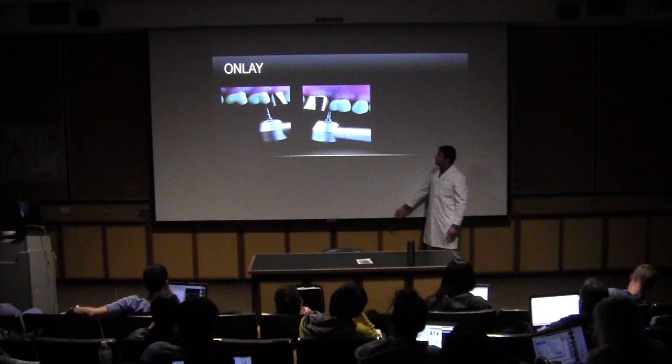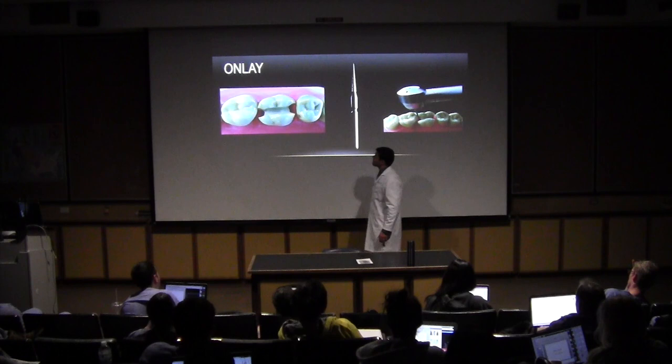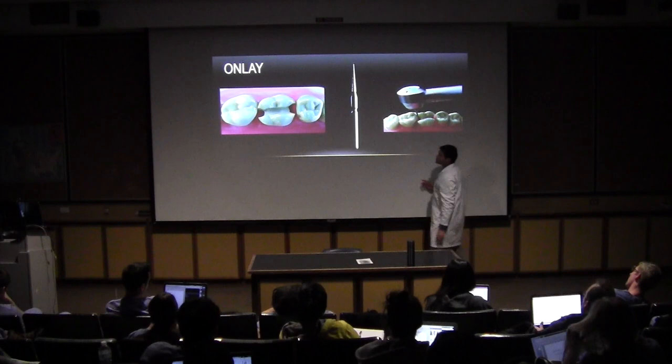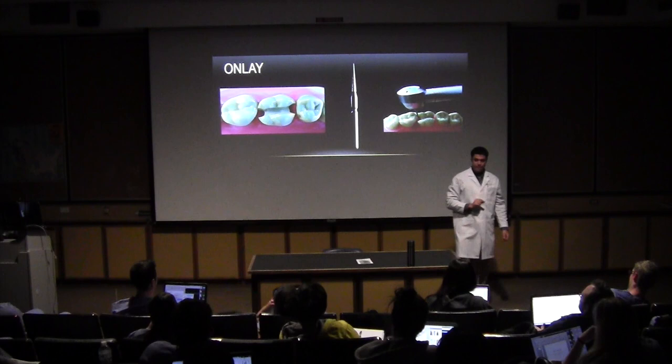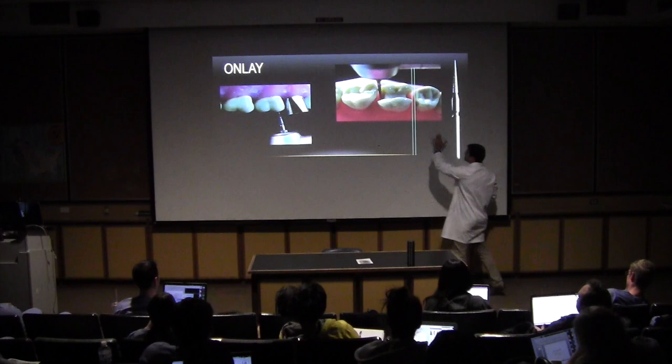And we are going to do the proximal boxes the same way that we did on the inlay prep. After shaving down the proximal box, again, use the needle diamond point to smooth the lines and angles between the axial and pulpal wall. And remember to have at least 1 millimeter of clearance between the tooth that we're doing the preparation on and the adjacent tooth.